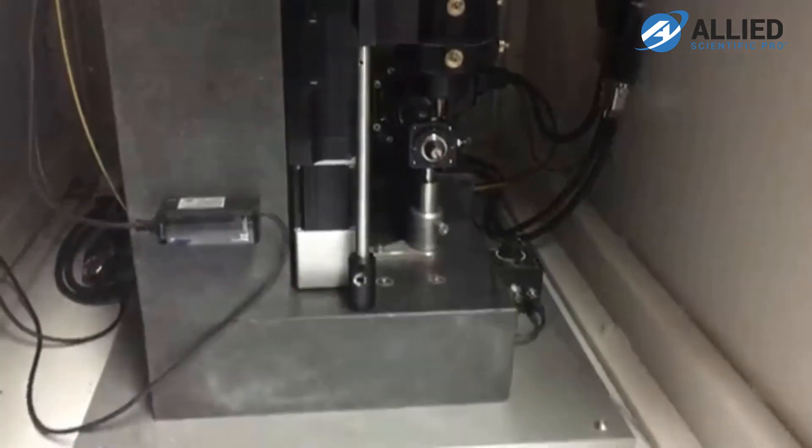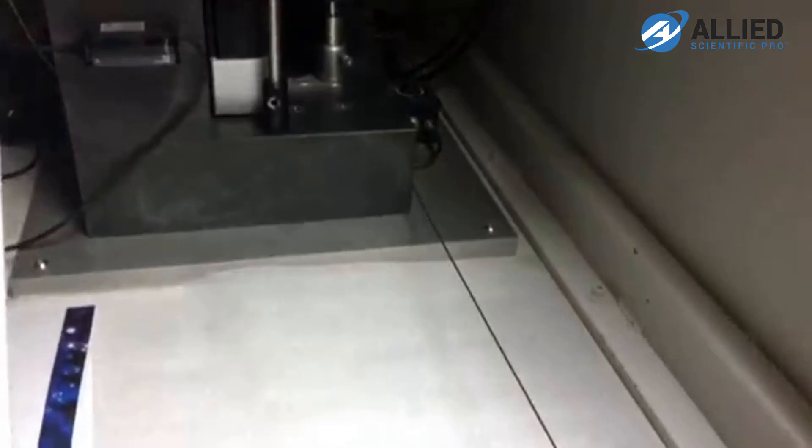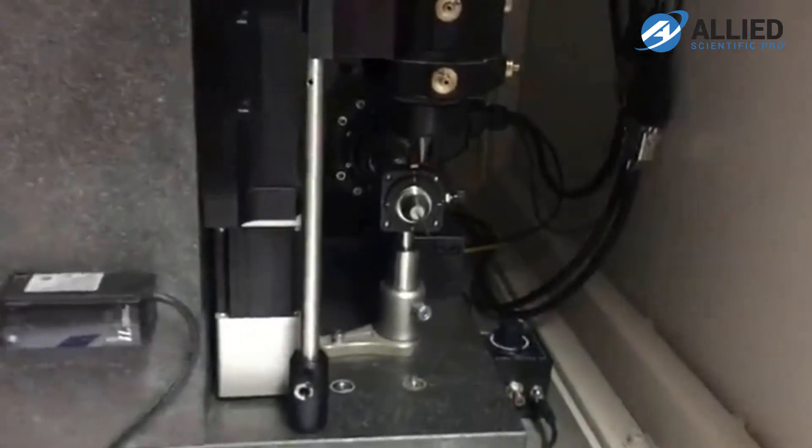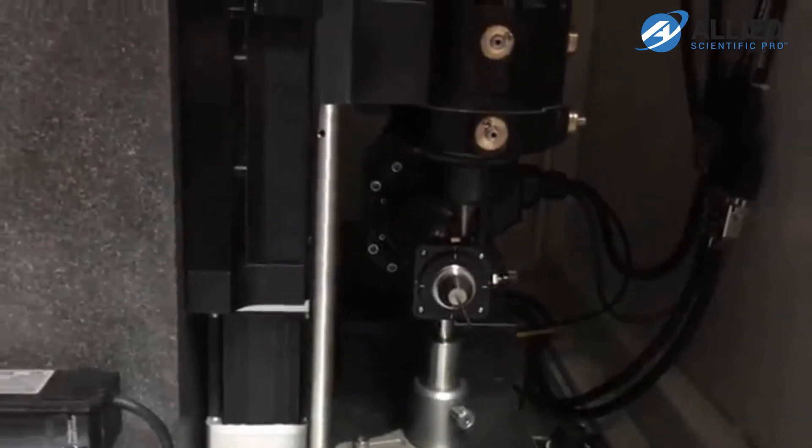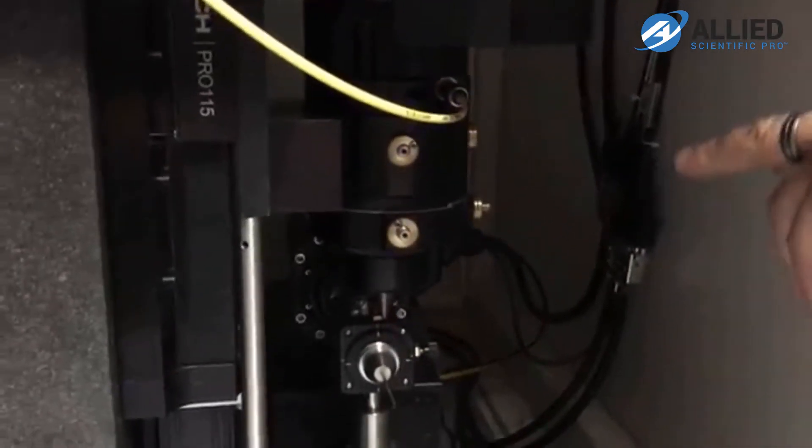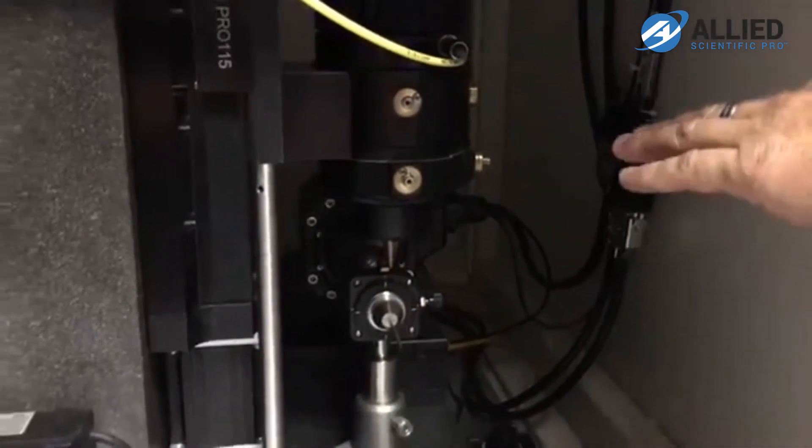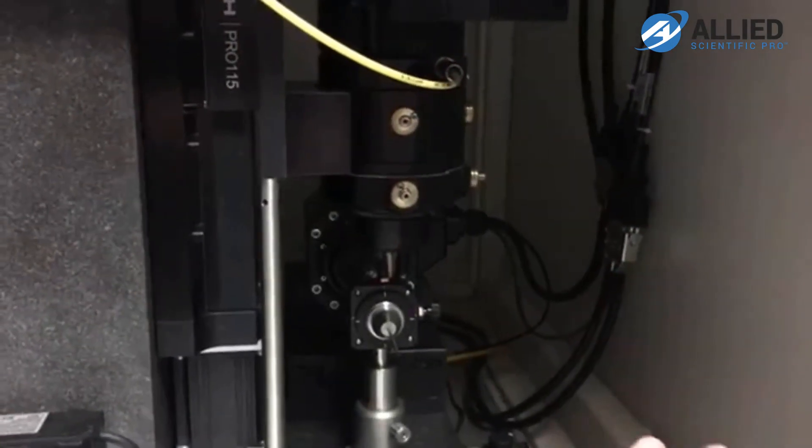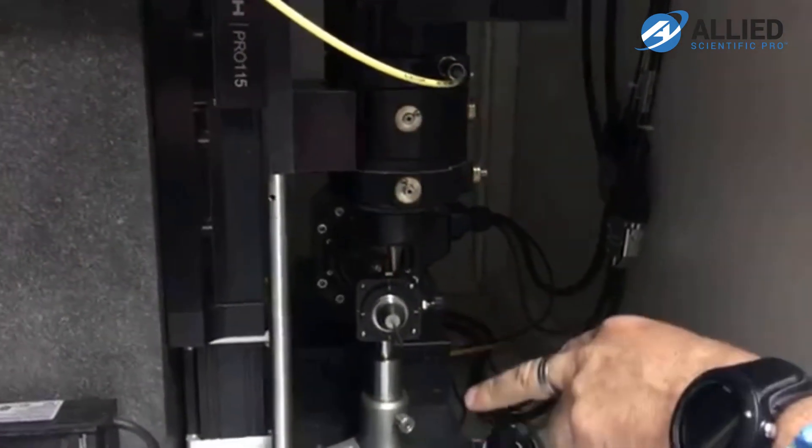This is an example of the tube. We have different bushings for different tube sizes and a pneumatic feeder for the tube so that you can move it forward during the laser ignition.